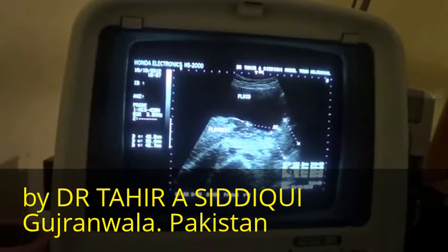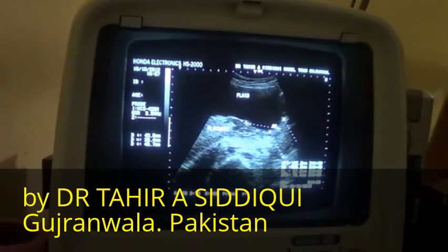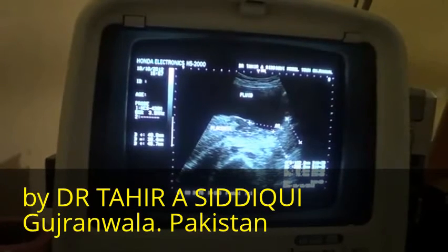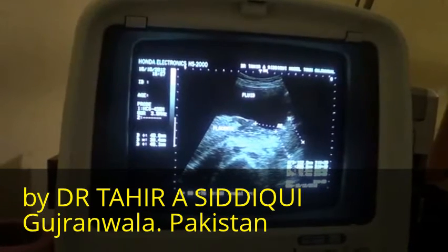We must see the length of the cervix. This is the 45.7 millimeter, rather I could take it up to this level, 40 millimeters.